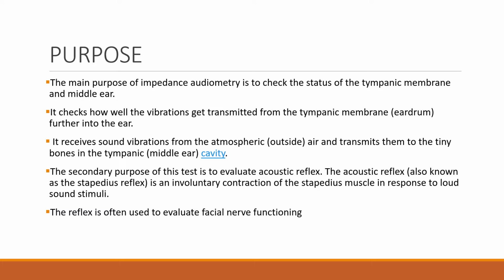The other purpose of this test is to evaluate acoustic reflex. The acoustic reflex is an involuntary contraction of the stapedius muscle in response to loud sound stimuli. The reflex is often used to evaluate facial nerve functioning.